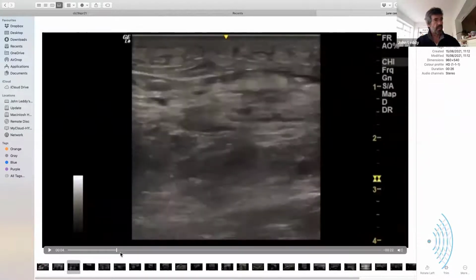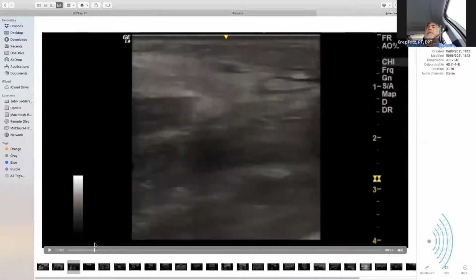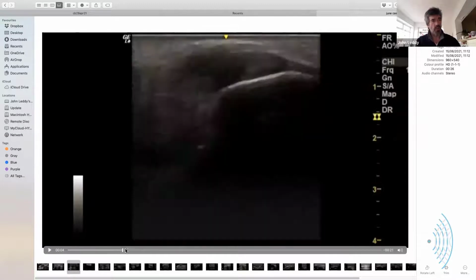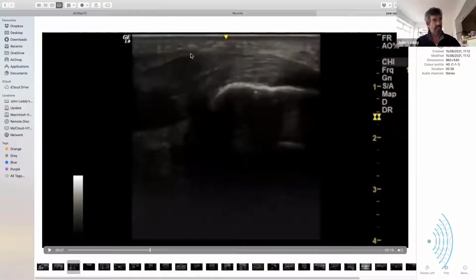but with fatty infiltration in that muscle. This is 2 months down the line, and they've gone on to rupture their Achilles. So this is the distal Achilles, and you can see that characteristic swelling of it coming all the way down from the insertion, which is what you see at your distal, and not going straight. So that straight away tells you it's ruptured.